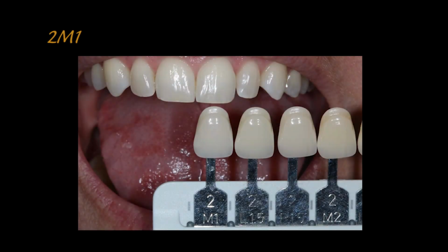So I hope that we broke that down in a step-by-step process: step 1 being value, step 2 being the hue, and step 3 being the chroma. And that's how easy this shade guide is to be able to pick the proper shade and be able to communicate that to the laboratory.